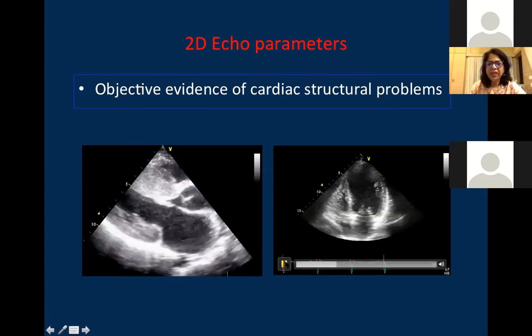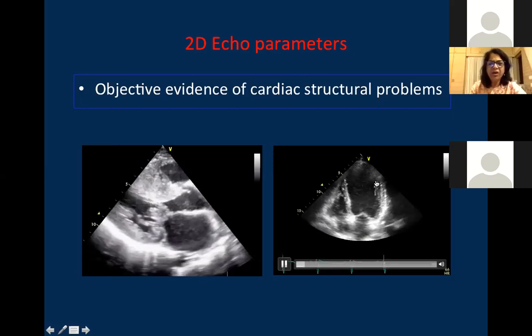So also this case where there is a large area of LAD infarction at the LV apex, scarred myocardium cannot relax, as we know. So this patient will have some amount of diastolic dysfunction.